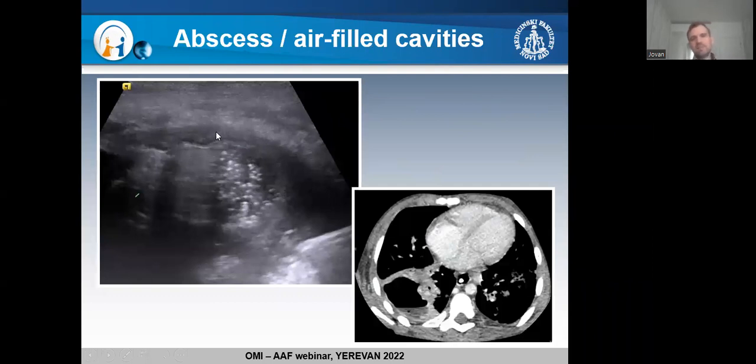Look here. This is tricky. This is tricky when you perform lung ultrasound, especially in patients with long-lasting pleural pneumonias, when this pleural effusion is completely organized. Sometimes it's very hard to distinguish it from the lung parenchyma. And it's one of those examples.